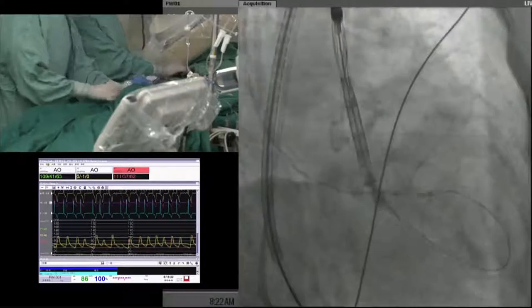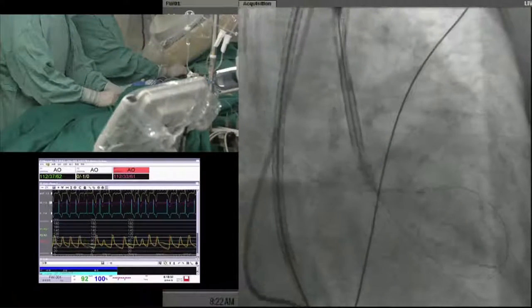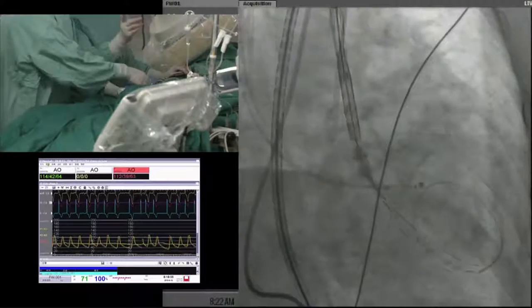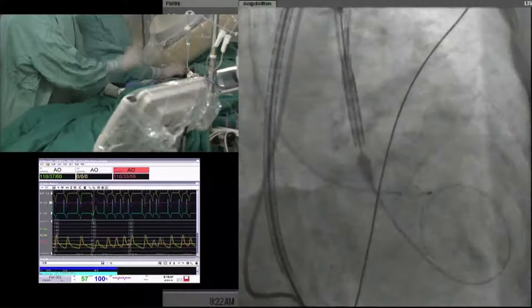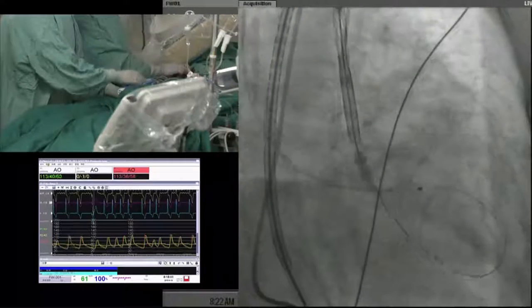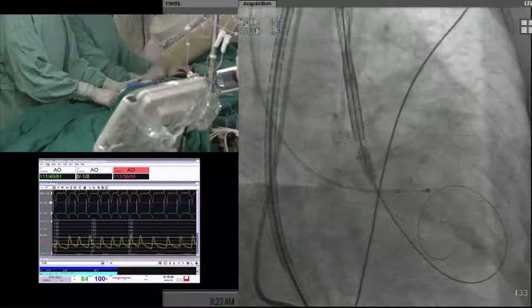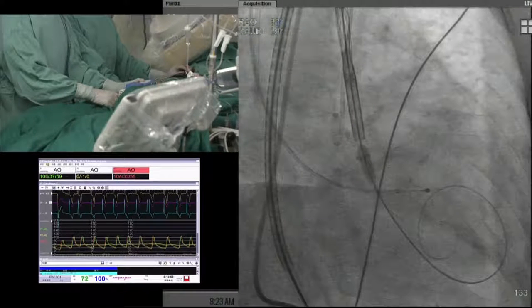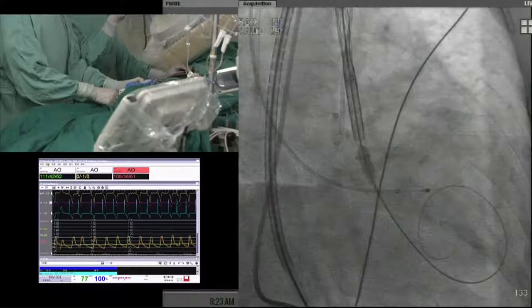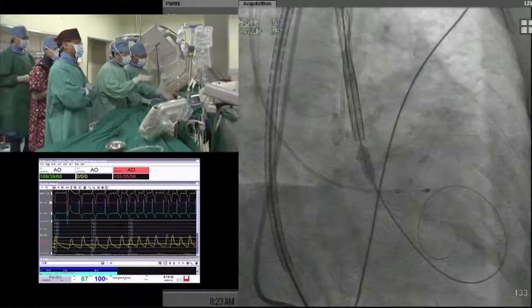Okay, very steep. Injection a little bit. It's back. So maybe it's just the picture. What is the height of the distal marked segment? Should we start in this view? According to our limited experience, we start the release at zero level. Oh, just a little bit, 2 millimeters lower.